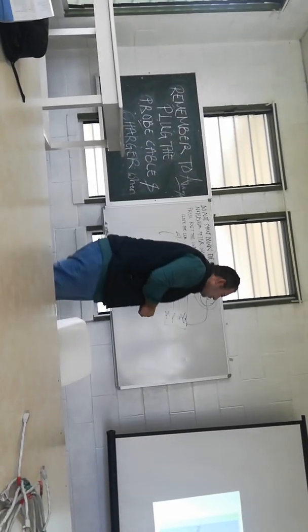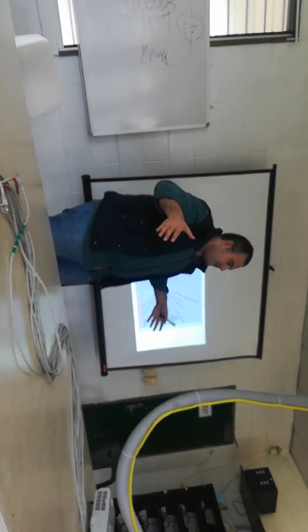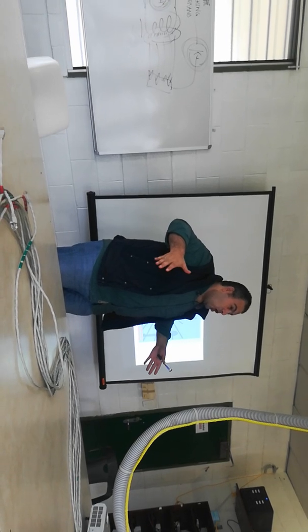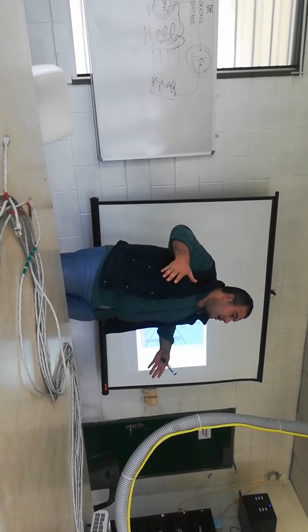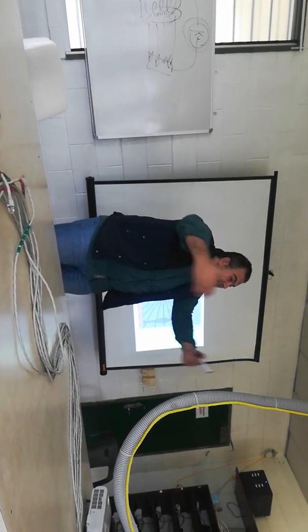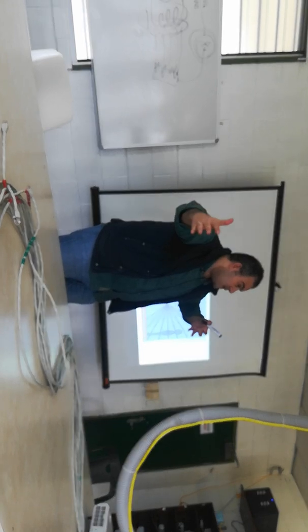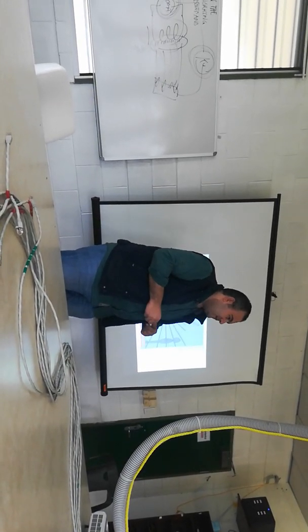But you have to increase milliampere for a heavy or fat patient. It's important to increase the number of photons, to increase the probability of interactions, and to increase the transmitted photons to get good image quality.